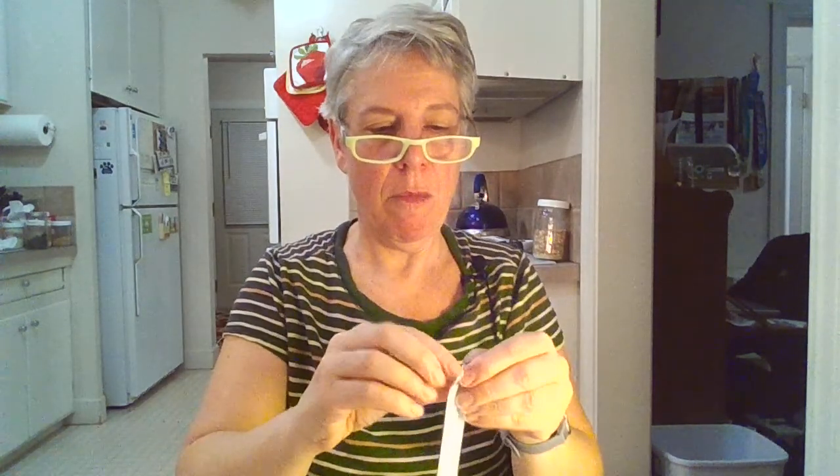Okay, open the swab package. Okay. So you open it, you take the end out, it says. Don't take the swab end, take the end out. So I'm going to cut the end stick part and take the swab out. Okay. Don't take the cotton part out. Take the swab out. Okay, don't touch the cotton. Don't touch your card.